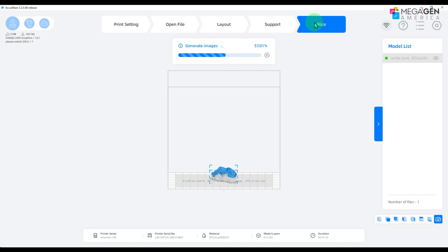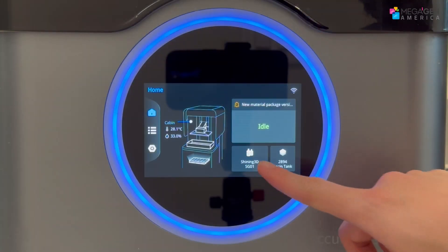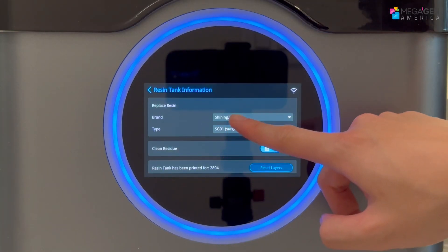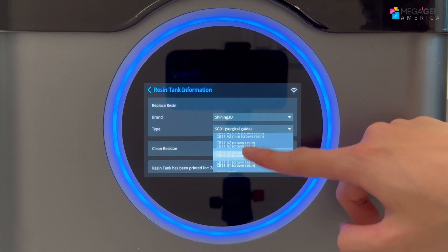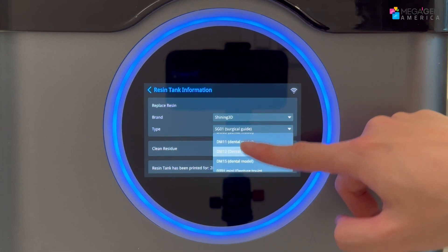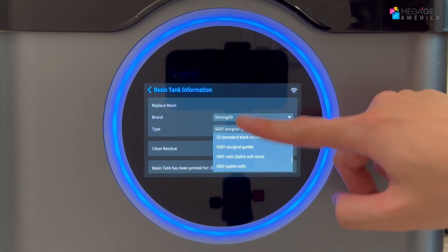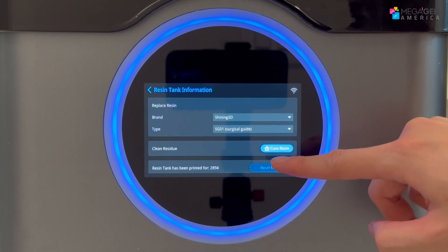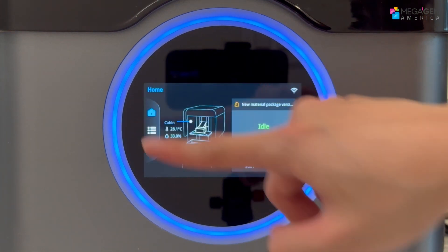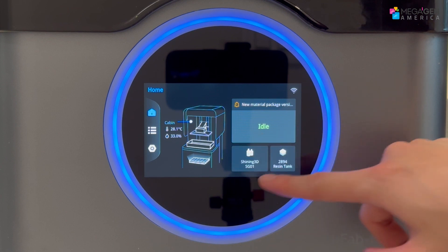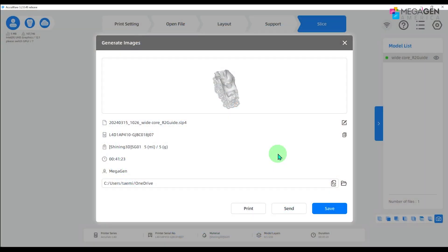Before you print, go to your printer and select the type of resin in the resin tank. Once the settings are confirmed, click print to proceed.